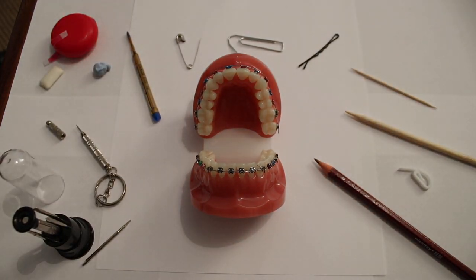If orthodontic wax or other materials such as cheese wax, chewing gum or Blu-Tac can't relieve this, it may be worth trying to tuck the wire back under the arch wire or bracket. It would be worth discussing doing this with your orthodontic provider first.